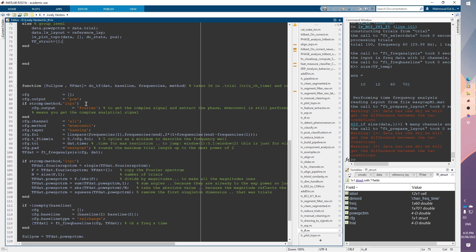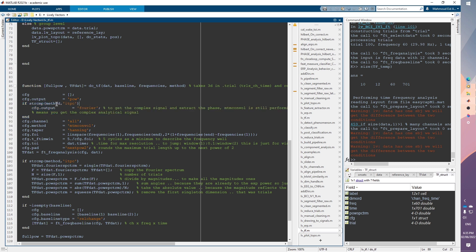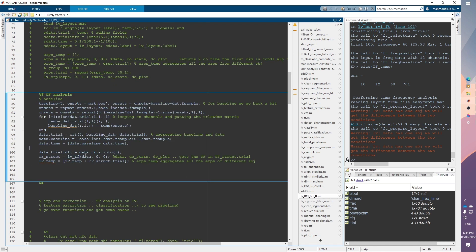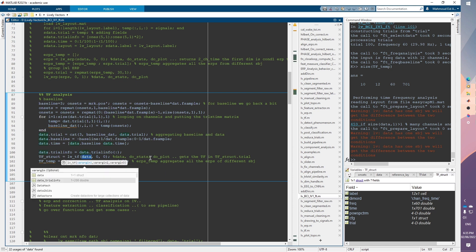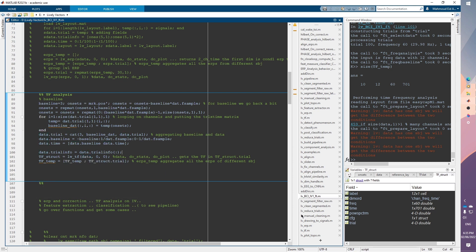I'm going to focus on this part of the analysis. When we are estimating the time-frequency, we are now specifying that we need to estimate the inter-trial phase consistency. When calling this function, you can pass another variable specifying the method to be 'itpc', which is the abbreviation for inter-trial phase consistency.